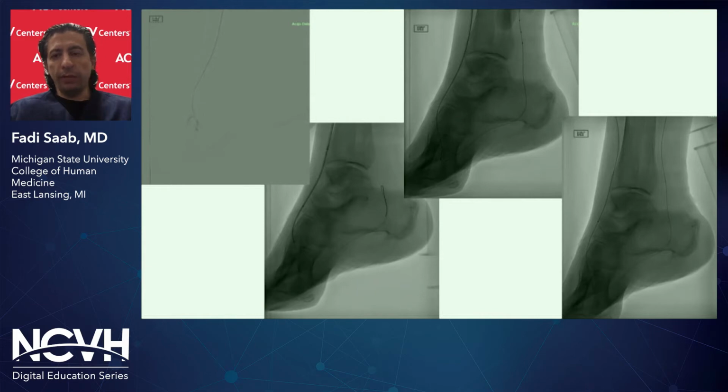Once you cross the CTO, you can ultimately deliver therapy. In this example here for this patient, you can actually access the anterior tibial artery in an antegrade fashion. So going back to our patient, this is our patient.